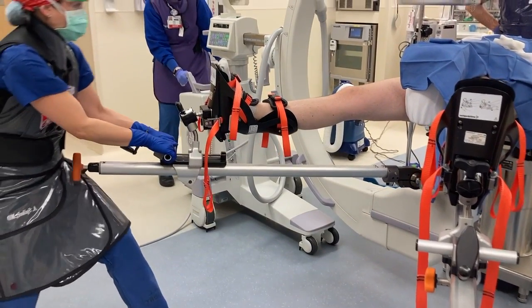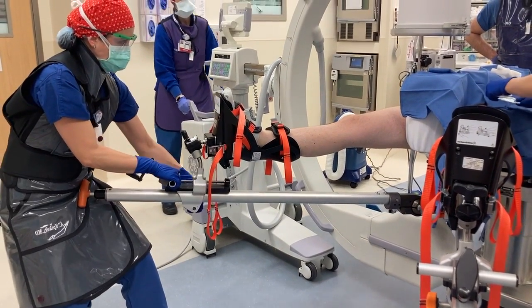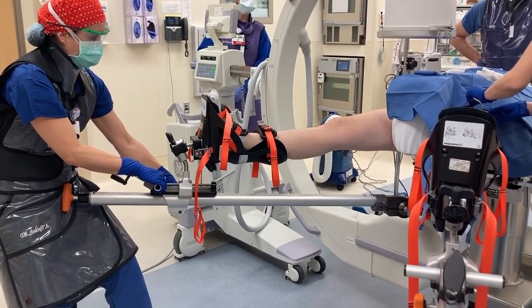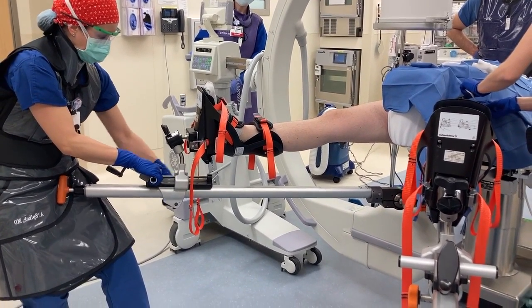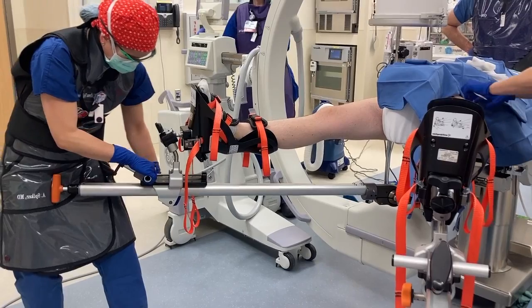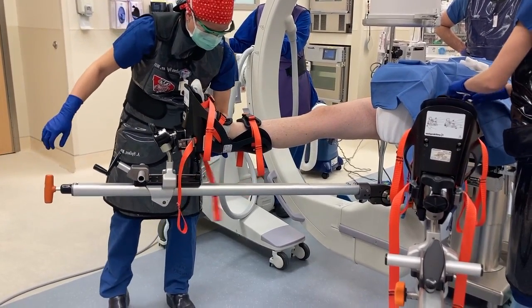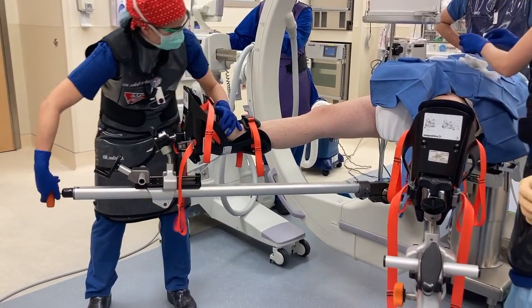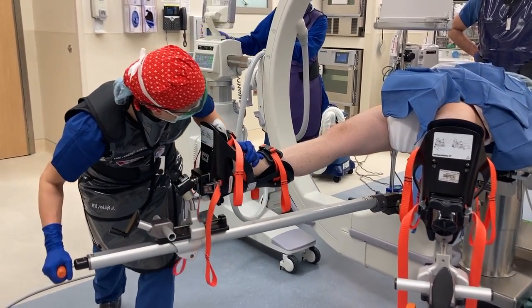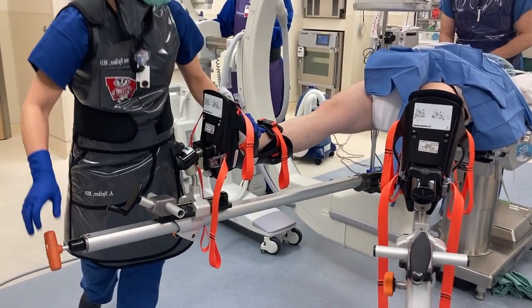The manipulation can begin with pulling gentle traction on the hip joint. This can be done with the use of a post. While the senior author's preference is to perform postless traction for the hip arthroscopy itself, in the setting of a postoperative manipulation under anesthesia, the post is useful in pulling gentle traction as it is only used for a few seconds, with minimal risk of pudendal nerve paresthesias.